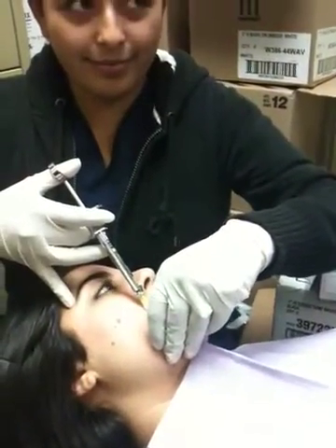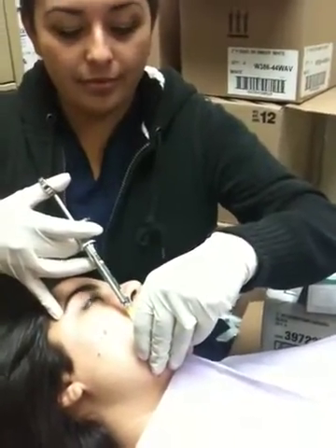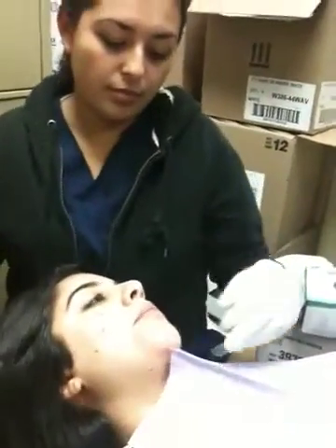It's almost like you want to be facing the occlusal plane of the tooth. If you're on the top, you're going to be in front. Oh, that makes sense.